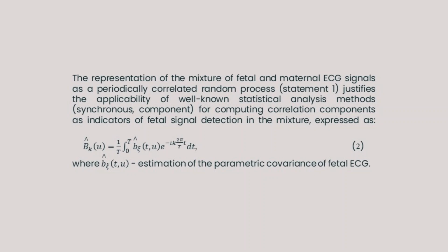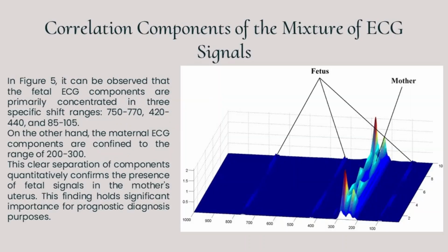The representation of the mixture of fetal and maternal ECG signals as a periodically correlated stochastic process justifies the applicability of well-known statistical analysis methods, synphase and component, for computing correlation components as indicators of fetal signal detection in the mixture.